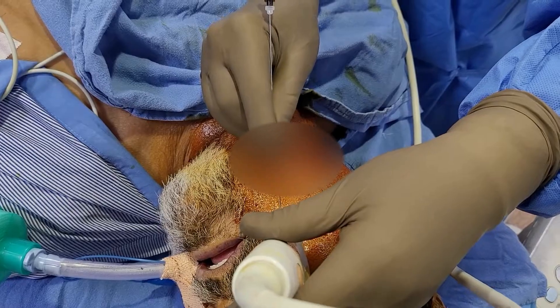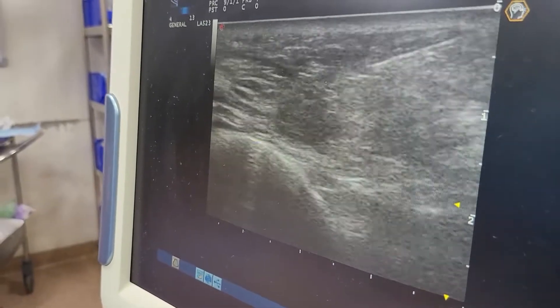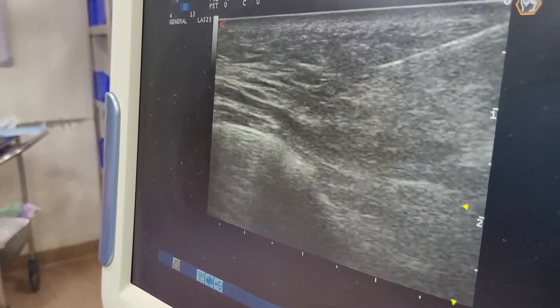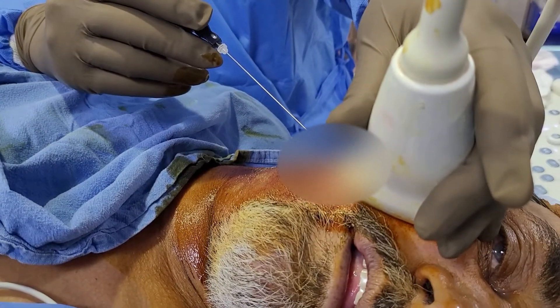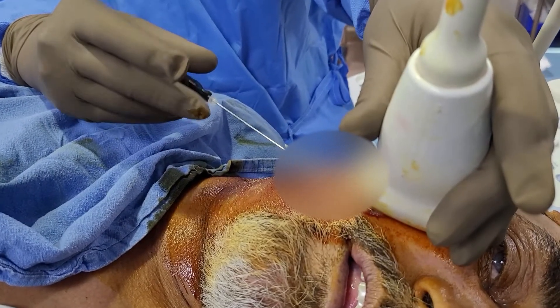Good morning. We have this case of indirect CCF and we are trying to enter through the facial vein and through the angular vein into the cavernous sinus.